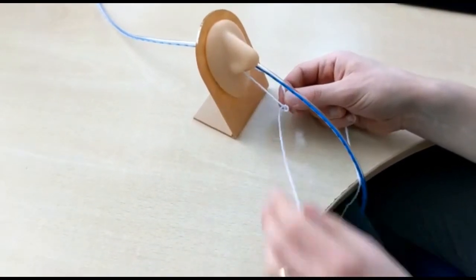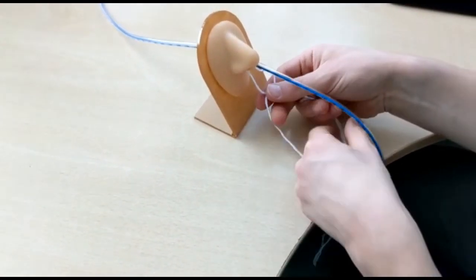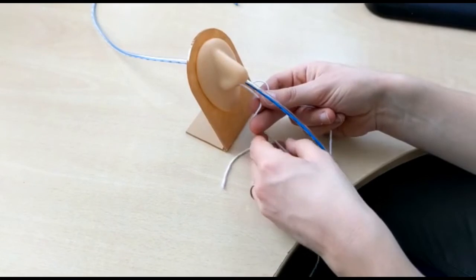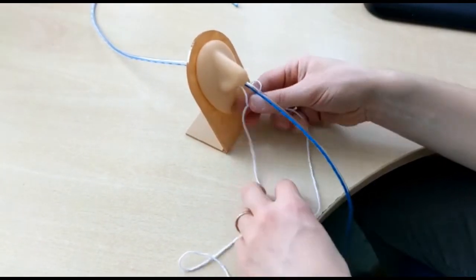Next, the string can be tied and clipped. You may wish to wait until NG position is confirmed on X-ray before committing to tying your bridle, using a sticker in the interim.